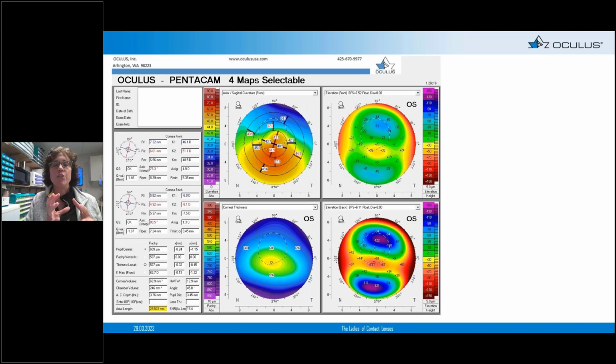I follow patients with corneal transplants this way because you can pick up local areas of edema, which may indicate that the graft is failing or you have a rejection episode. So you really want to look at those isopacs and make sure that they are centered and even. In this particular patient, who has a very thick cornea, I also look at the center, but also the thinnest locale, to see if this patient is potentially a candidate for collagen cross-linking.